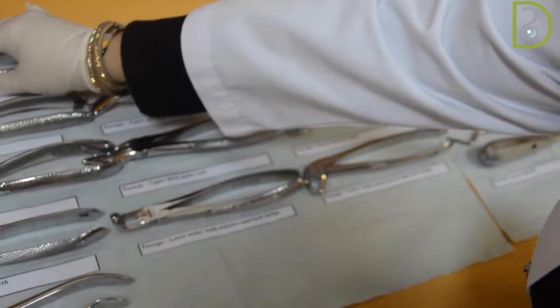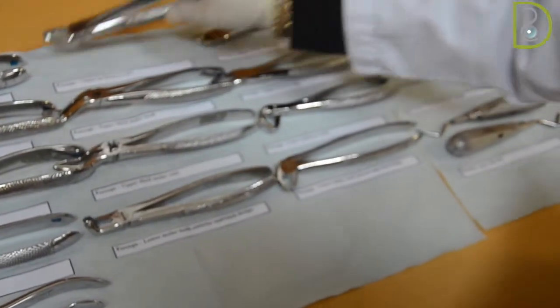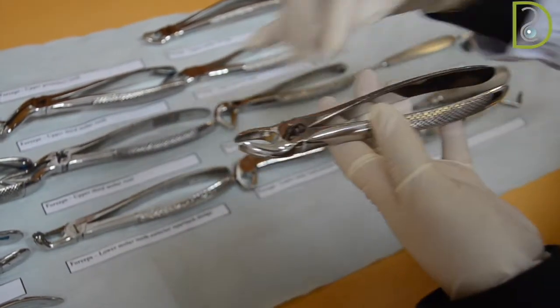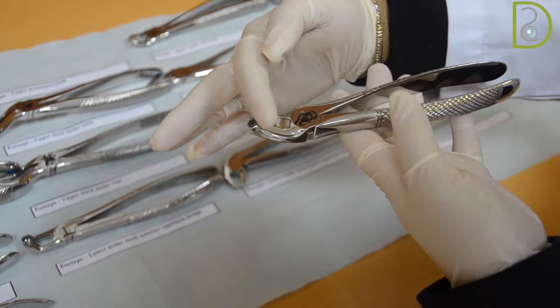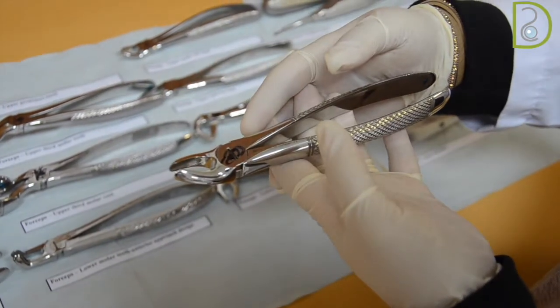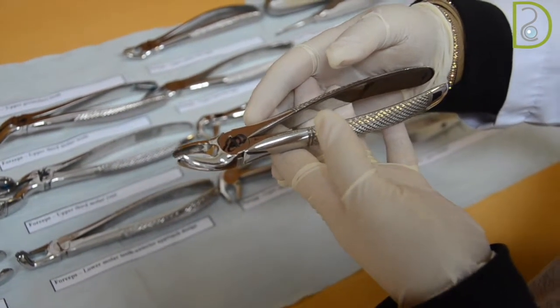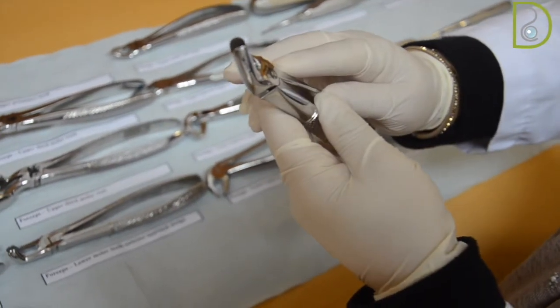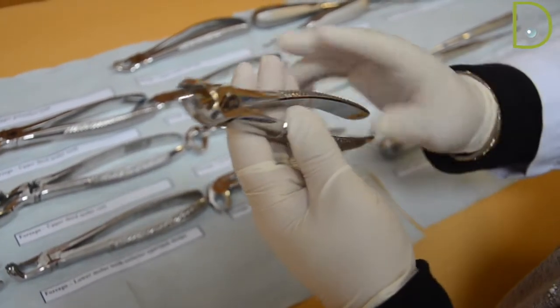Now we will talk about the upper premolar forceps. As you can see, the beaks are a little bit curved upwards to reach the premolar region, and they can work on both right and left premolars.